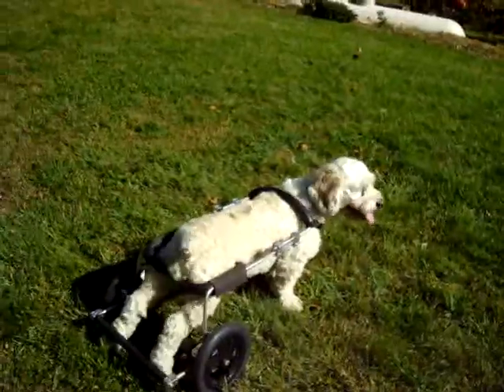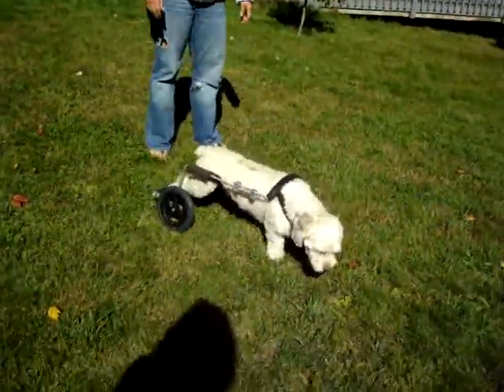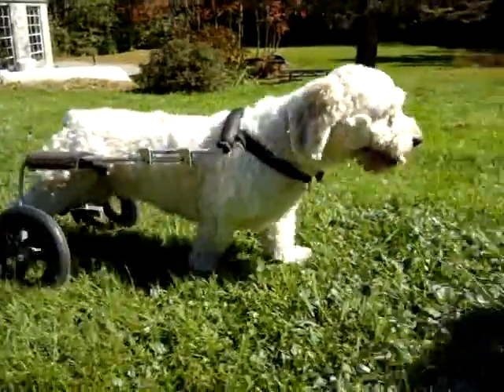Go, go, go! Look at those feet — she wants to move her legs. Come on, let's go. I can't take it. Come on. She's moving her legs. Oh yes. There you go. Good girl. All right, Chloe.